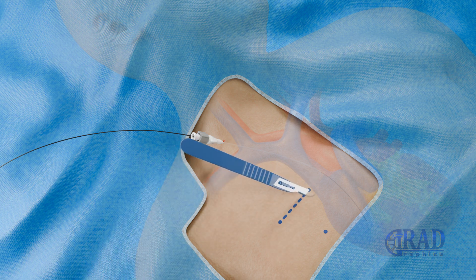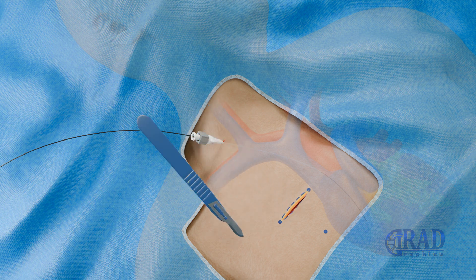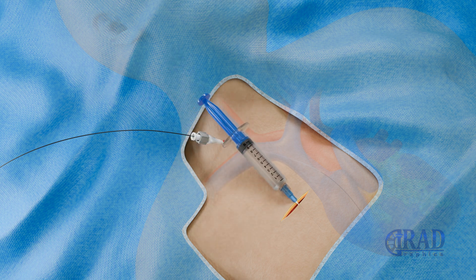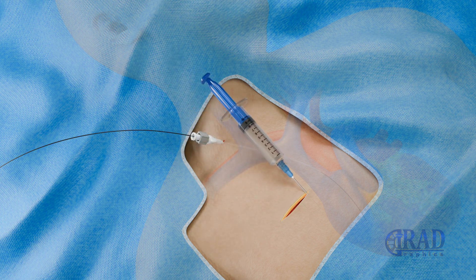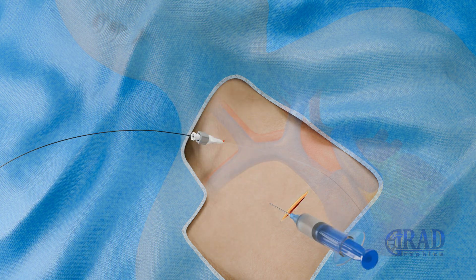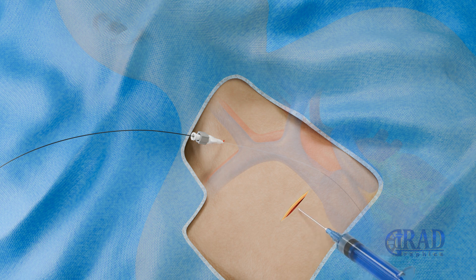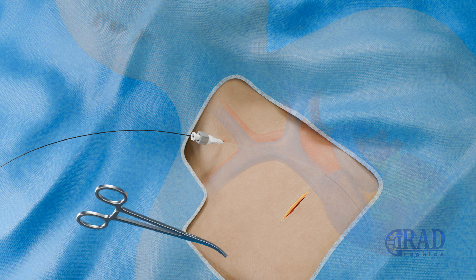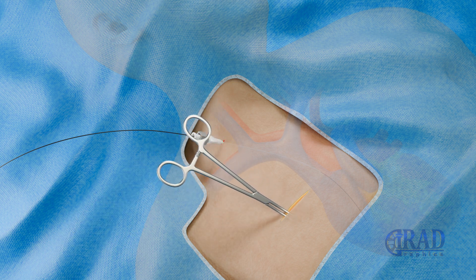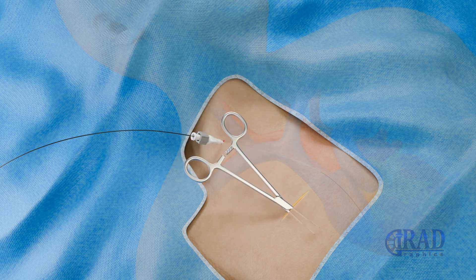A small incision is made in the upper chest to provide access for port pocket creation. Repeat local anesthesia is performed to numb the port pocket itself. Using a clamp, the subcutaneous tissue is gently dissected to create a pocket for the port, ensuring adequate space for secure port placement.